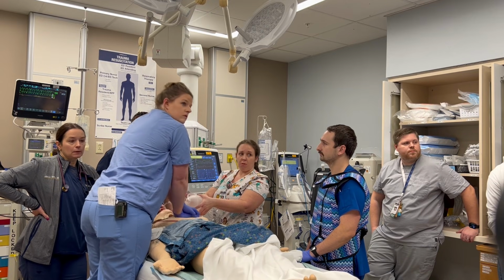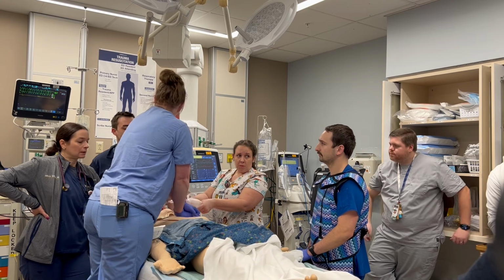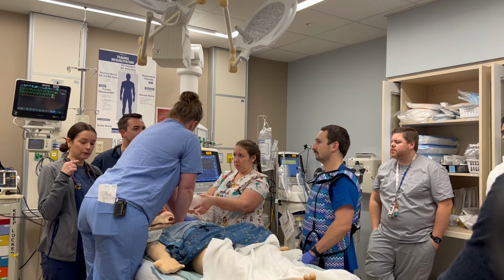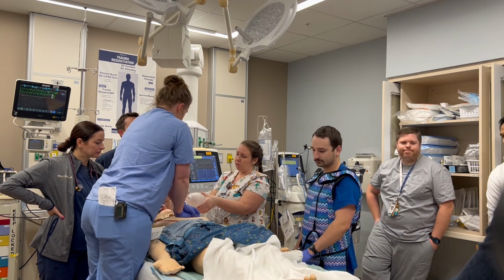Jared, do you want any other drugs? Let's have him packaged so that as soon as they're ready to take him, we can have him ready to go, as far as monitoring stuff.